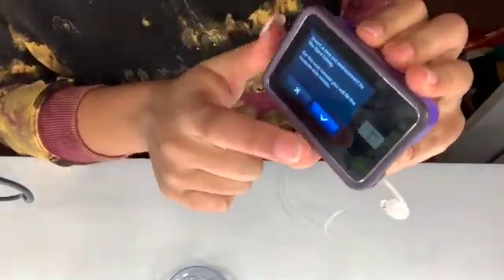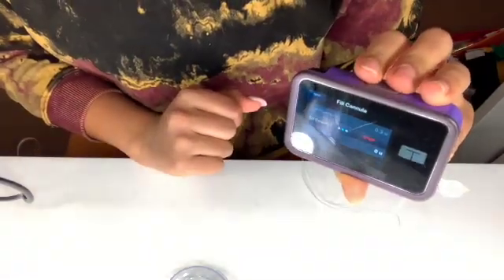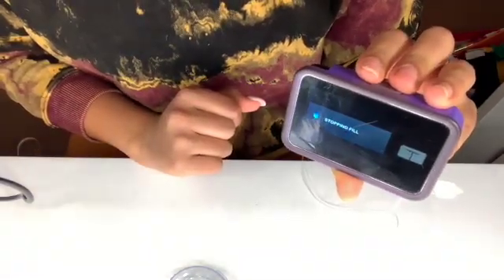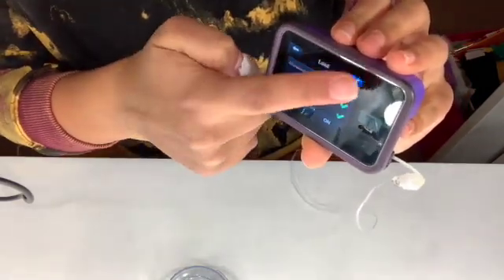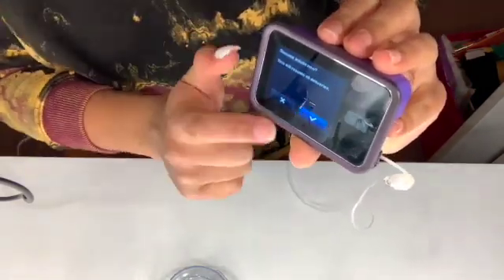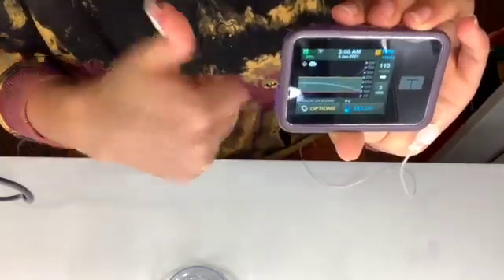And then we're going to unlock our pump again, go to fill cannula and press the recommended amount that your doctor told you, and then it'll fill the cannula, and then you press save, and then it'll ask if you want to resume insulin, and then you will resume insulin, and it is all done.